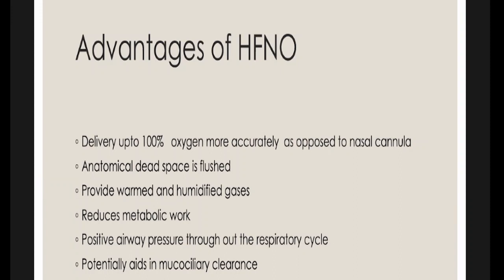So that is why I am telling you all, it reduces the metabolic work, because the high flow will already humidify and warm these gases, so that by the time it reaches the lungs, it is warm. So the patient has no need to use any of his calories to do this job. That is how you can save some energy for critically ill patients, because their calorie reserves are very important. Even 150 calories will be very beneficial for them to reserve. Because they are spontaneously breathing, they have to use energy for breathing as well. So at least we can save some energy.